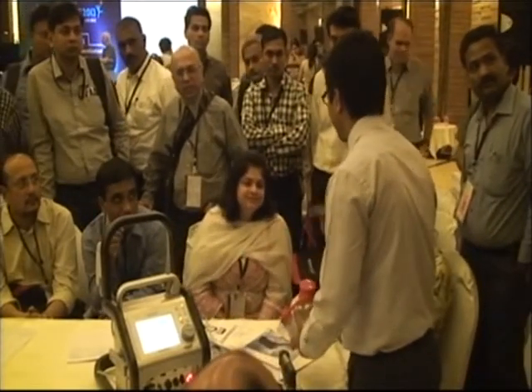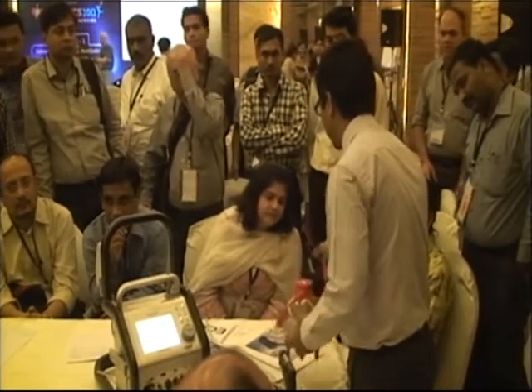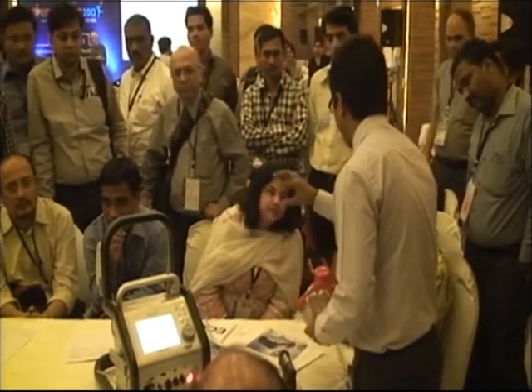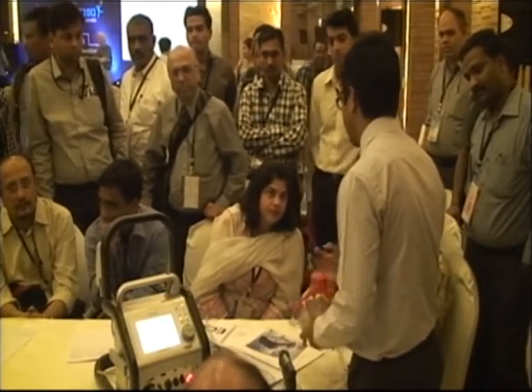Aorta will cannulate after the coronary. Wherever we cannulate, the blood is going to go everywhere. Yes, so backwards also it will come. It is always Pascal's law. It will fill up whichever outlet it gets.